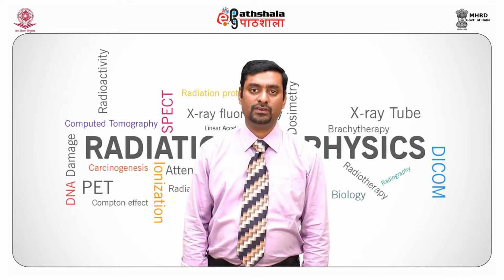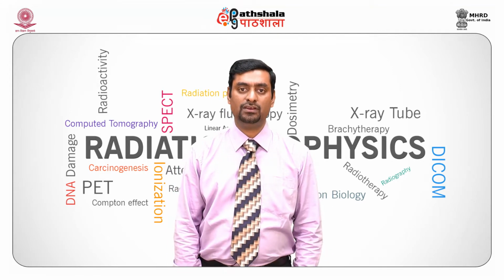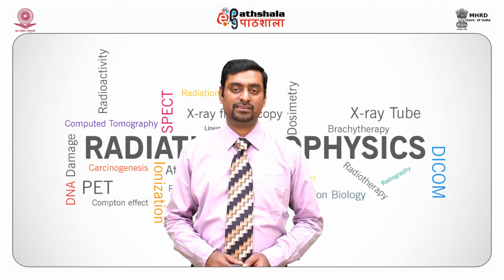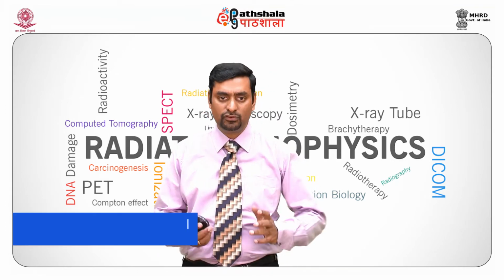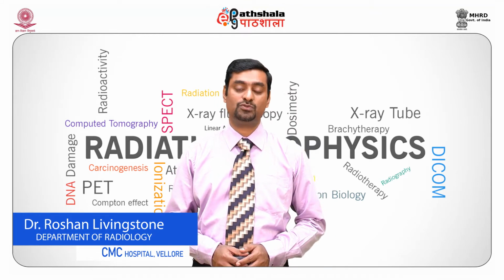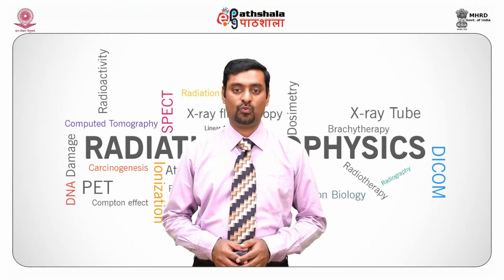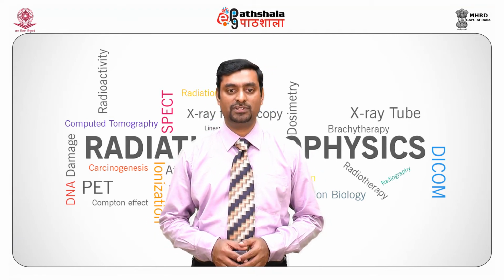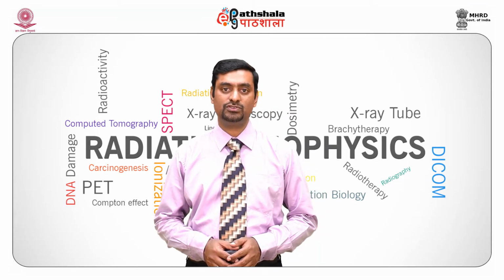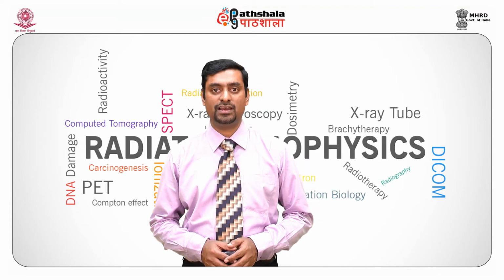Grid. The grid is used to reduce the scatter from the patient which is reaching the detector, and which also improves image contrast. The use of a grid increases radiation exposure. In fluoroscopy systems, the grid ratios range from 6:1 to 10:1. It is good to remove grids while imaging pediatrics and thin patients.